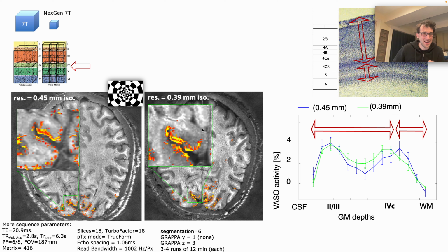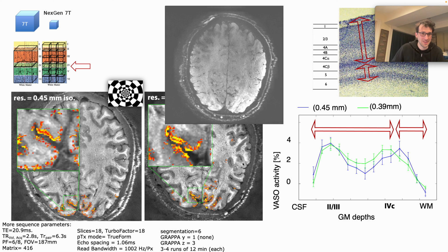And even there, I don't think this is really the physical limit, because when you look at the raw time series movies here, you do see that there is noise, but it's not really the salt and pepper noise that you would expect for a thermal noise dominated regime. So I think with more artifact hunting sessions, you can go to higher and higher resolutions still until you ultimately hit the thermal noise limit. And at the end, I was glad that David pushed for more scans because it just gave us more data, also across sessions, that we could combine to look at also more areas.